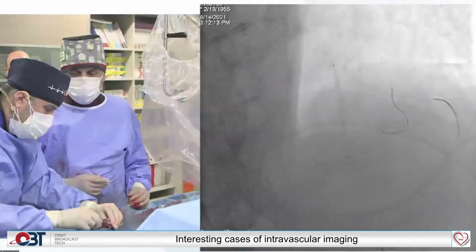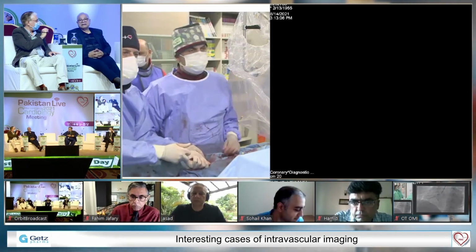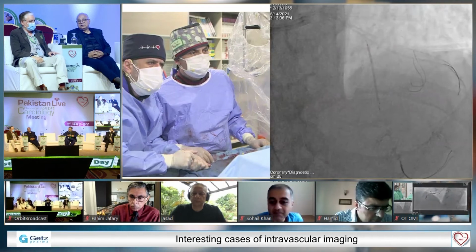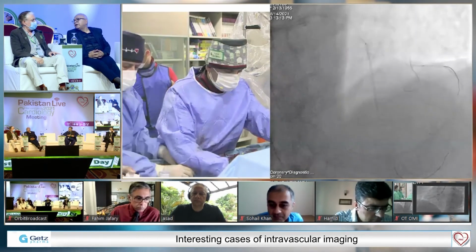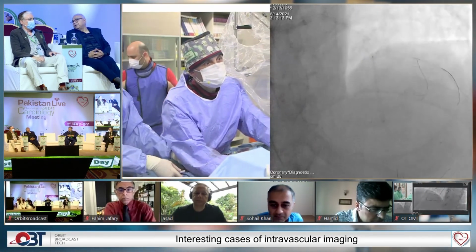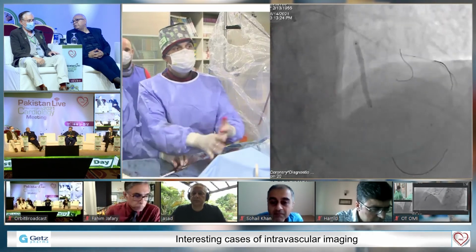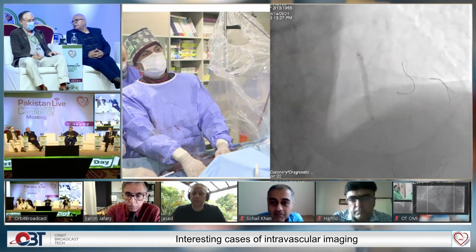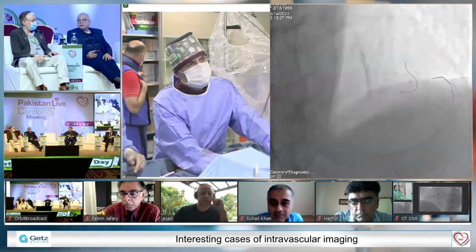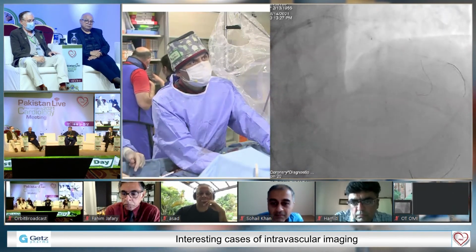A little bit more distal maybe. Maybe here, right? Okay. Let's go up here. Okay. All right. Is this a 3.0 or a 2.75? 3.0, yeah. 3.0. Down. You went a little bit down, I guess.